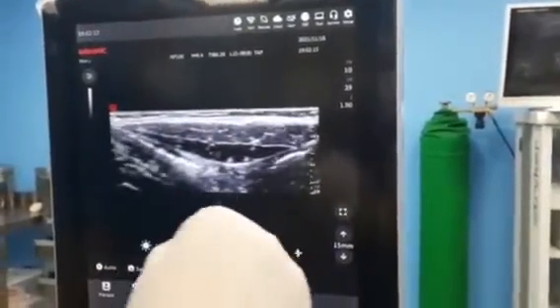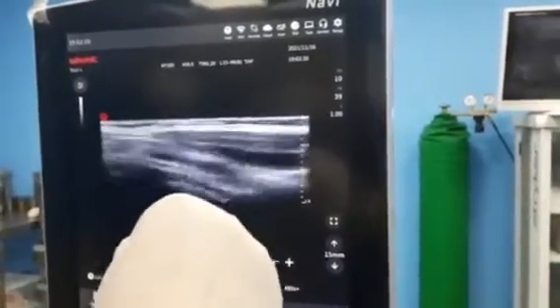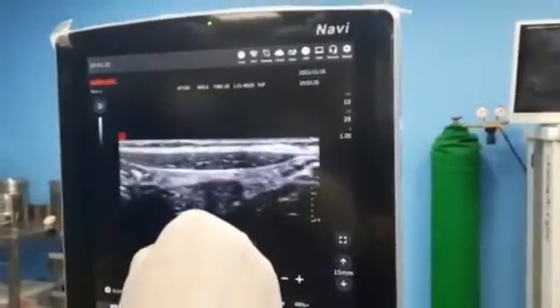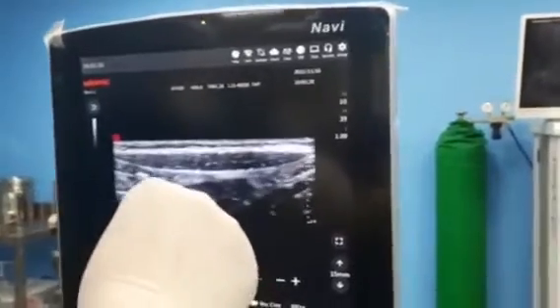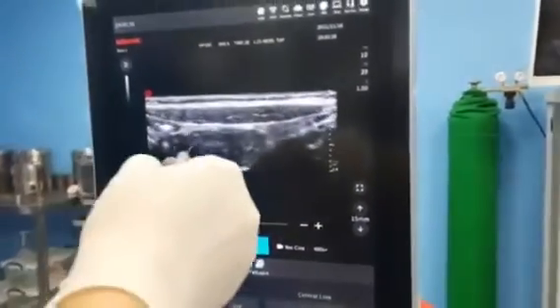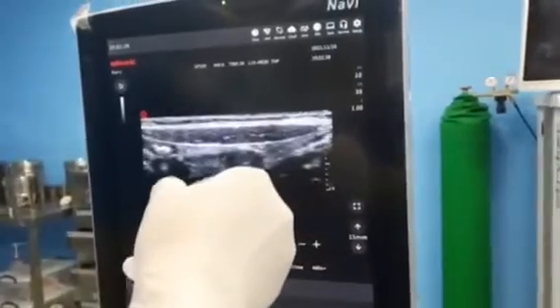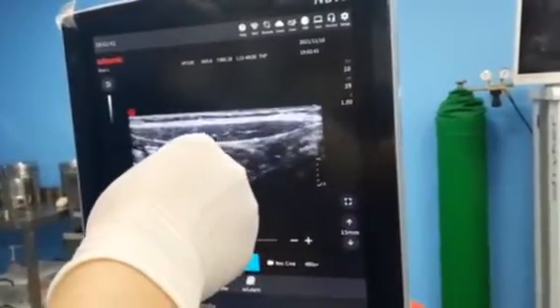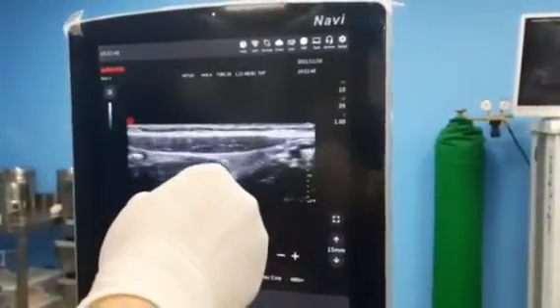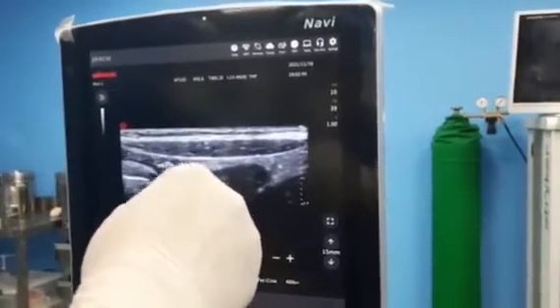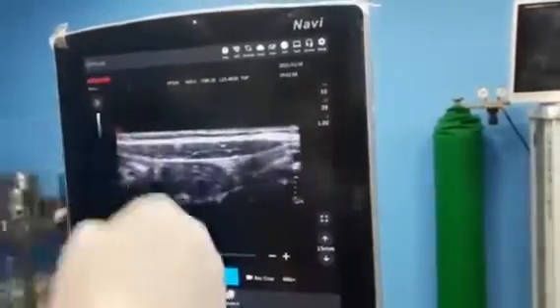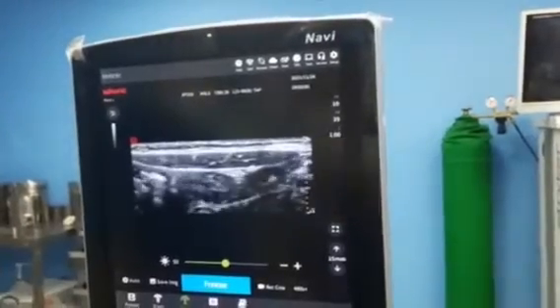This is the spread of the first rectus sheath block. It's important to see the posterior aspect of the muscle, which corresponds to the fascia and the transversalis fascia. When you perform the block, you need to make a distinction between these two elements — this is key to performing a correct rectus sheath block.